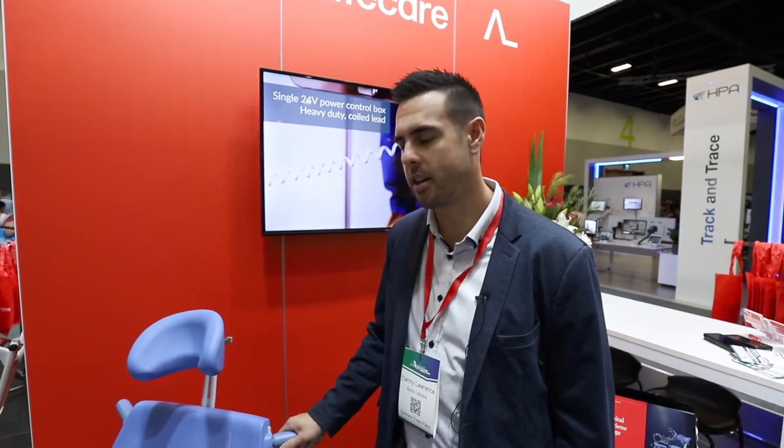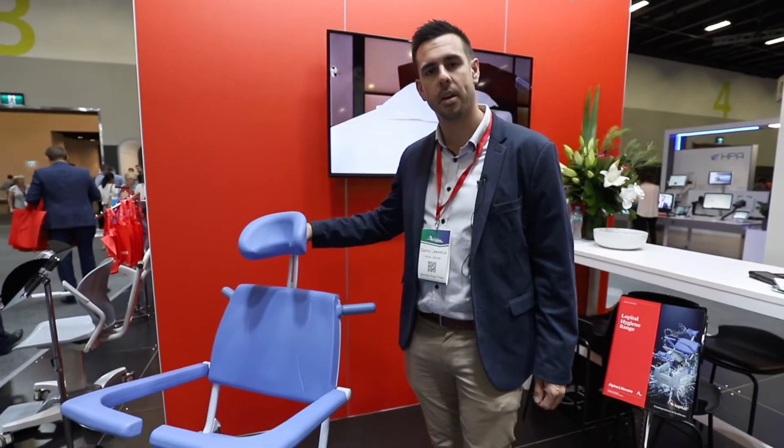Hi, I'm Danny from Alpha Life Care and I'm going to be showing you the L'Opital Reflex. L'Opital is a company based out of the Netherlands.